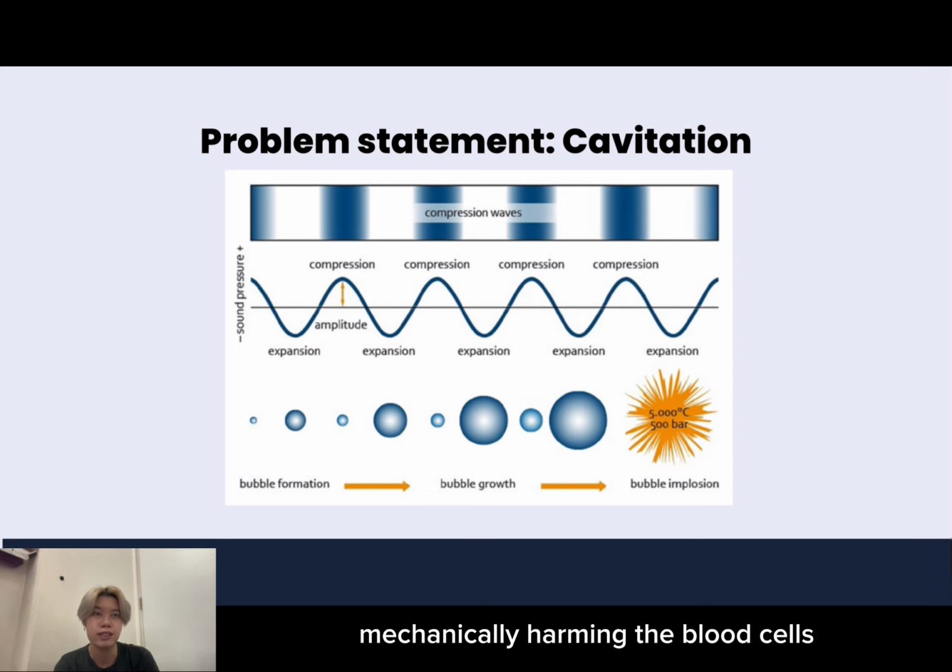Possible solutions and recommendations for cavitations from ultrasound include, firstly, cavitation monitoring. Use monitoring strategies to evaluate and manage cavitation. Doctors can monitor and control the cavitation effects during therapeutic operations to make sure that they stay within safe bounds, with real-time imaging or acoustic feedback devices.